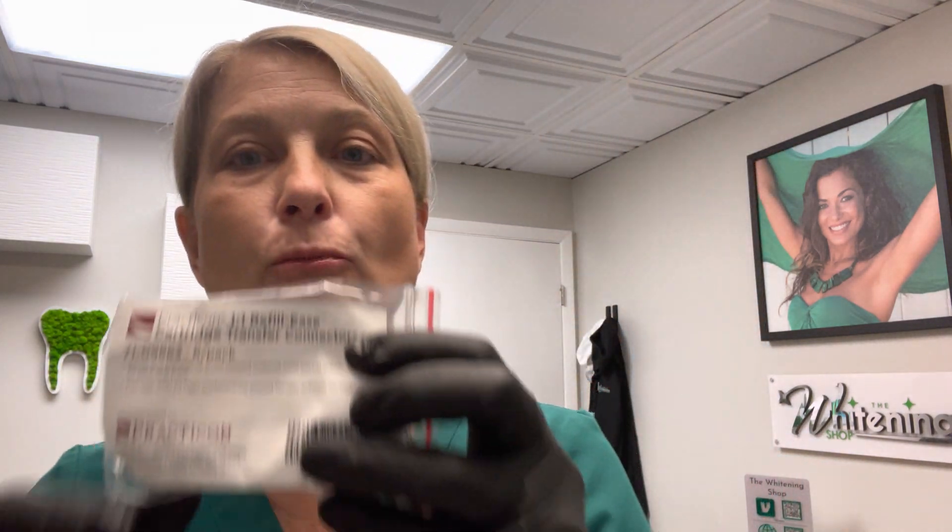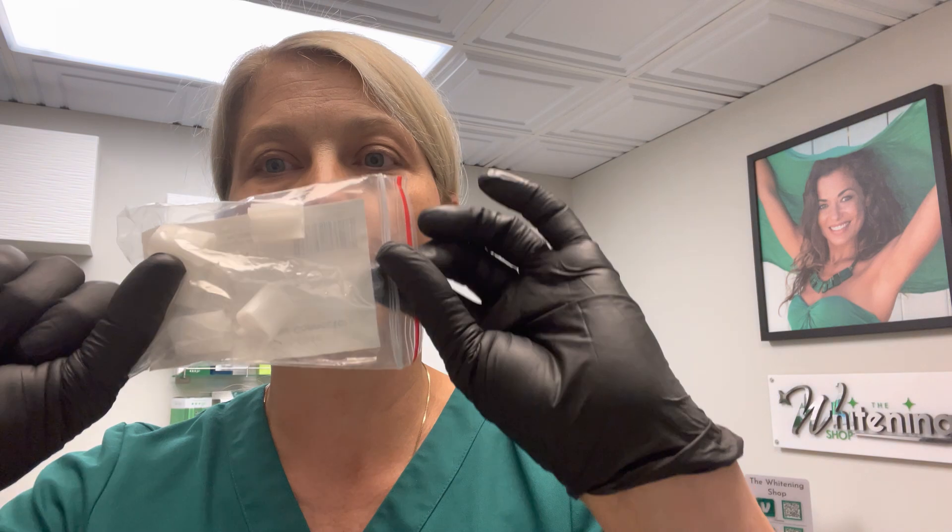Well, Practicon is a company down in South Carolina. I really do love a lot of their little niche products. They have these little pieces — they have them for the 10-to-1, and also for our 1-to-1 refills. They're just little pieces of plastic that fit on the end of the cartridge, just like where we would place the tip on, and you would just basically place that onto the end.